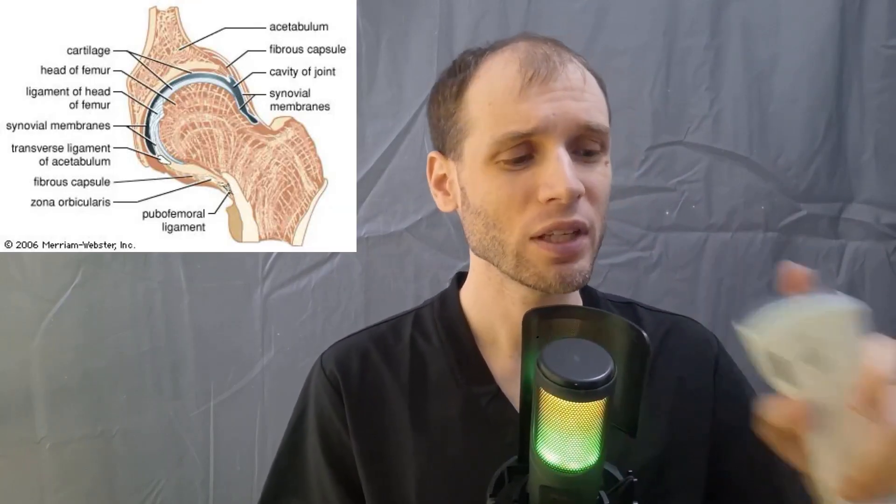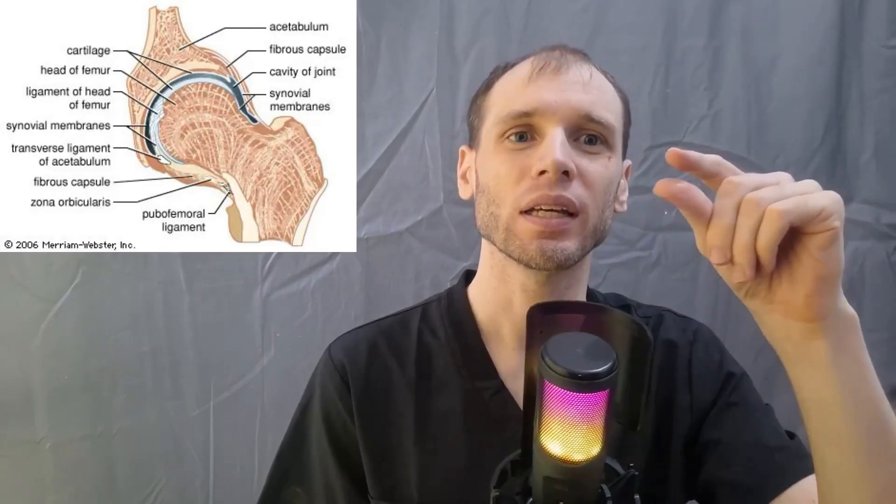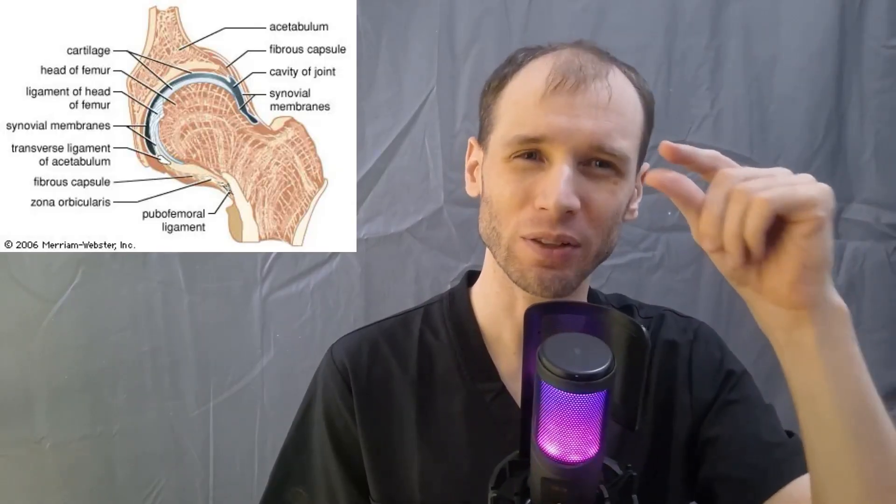I'm going to use the curvilinear side and that should give me a pretty large field of view, which will make it easy to figure out where I am, and I'll see if there's fluid in the joint capsule of the hip. The joint capsule of the hip itself sort of goes one way and then bends back on itself, and the capsule wall is about two to three millimeters thick.